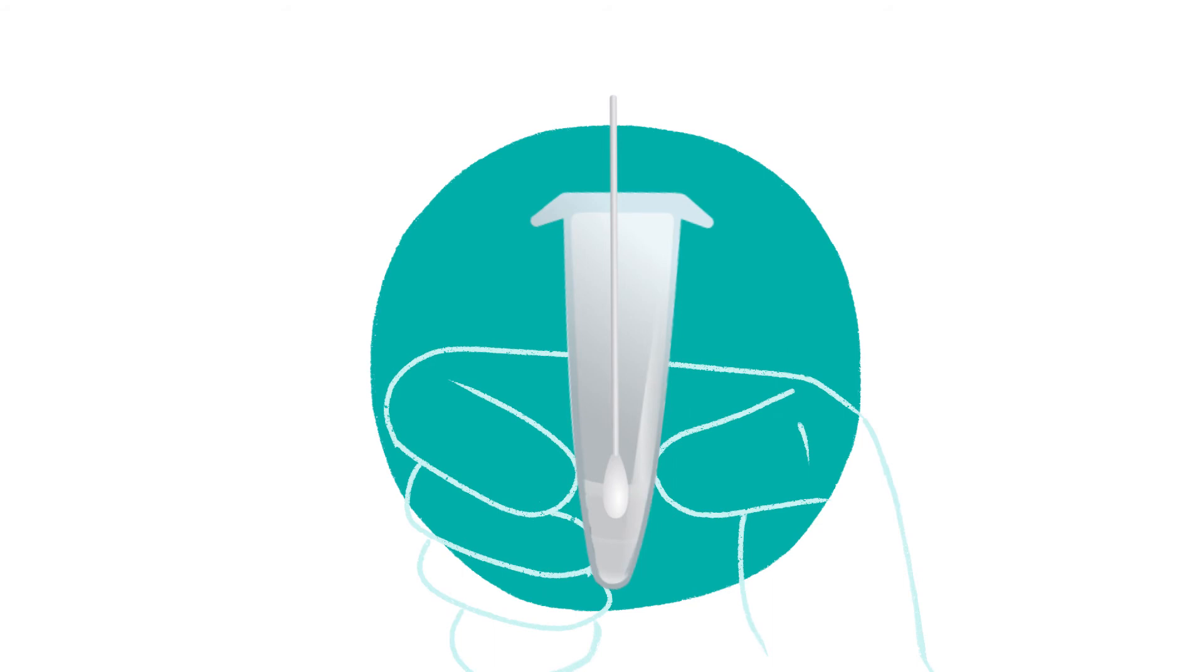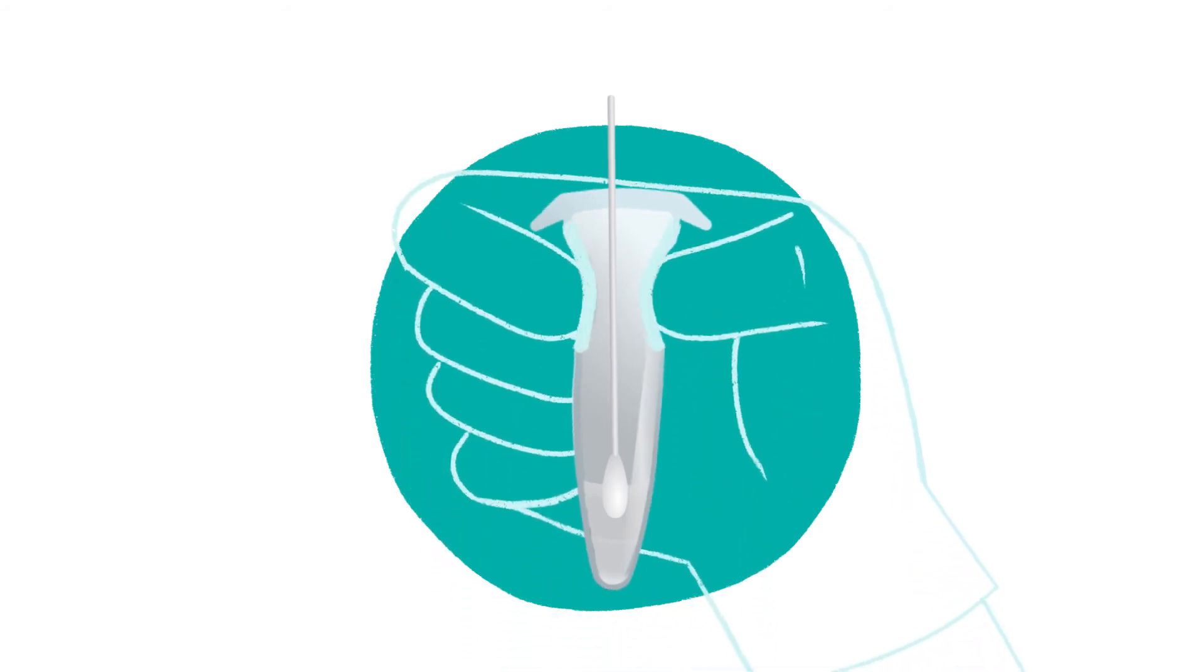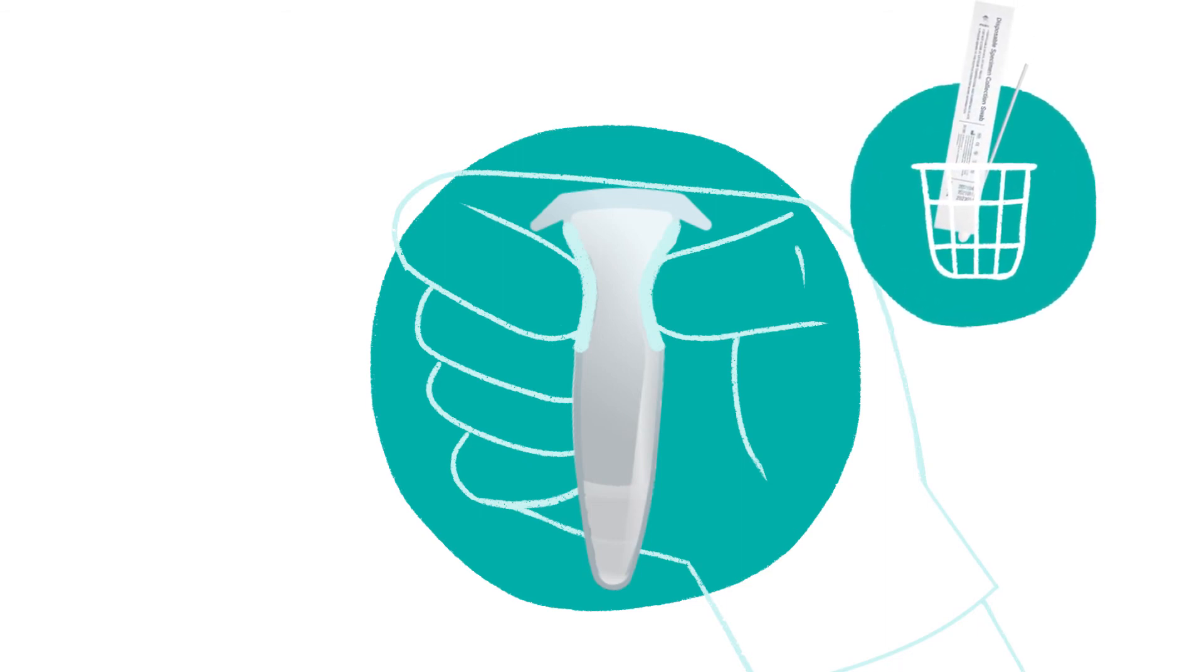Next, while squeezing the side of the vial, rotate the swab to release the liquid and then remove the swab. Discard the swab after use. For more details, please check the safety precautions section of the package insert.